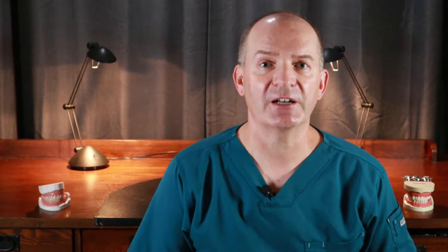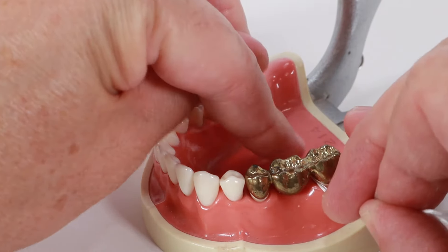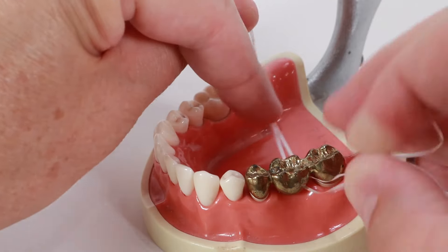Once you are finished with the front tooth, slide the floss back under the false tooth and do the same thing with the back tooth. Once you are finished with the back tooth, pull the floss and the floss threader out from under the bridge.